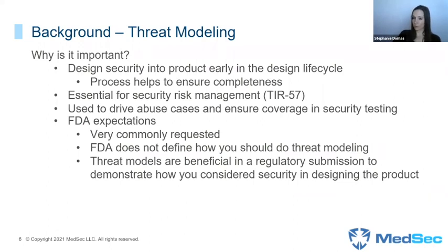It's important for a multitude of reasons. Hands down, designing security through the life cycle of your medical device is critical, and threat modeling helps be that input into some of the early stages of critical design decisions. If you understand the threat landscape of your device, it's easier to make those decisions. It is hands down essential for security risk management. If you follow TIR 57, some derivative of it, or you've built your own in-house system, regardless of what you do, I would lay the claim that threat modeling is a foundational piece of your security risk management, and that you would struggle to do security risk management well if you don't do threat modeling.